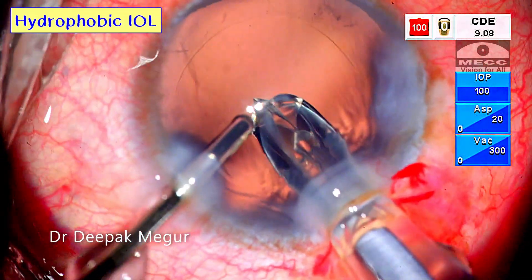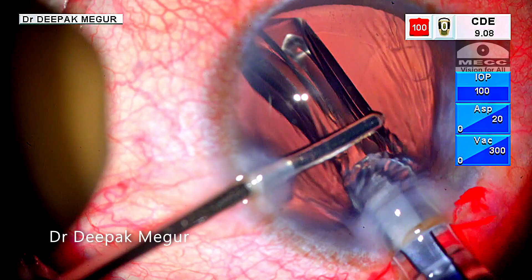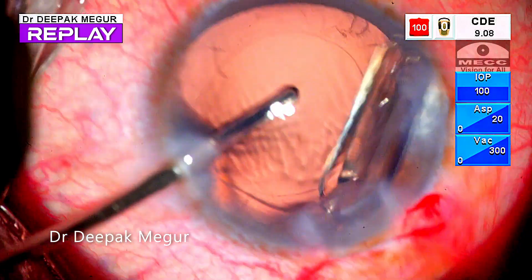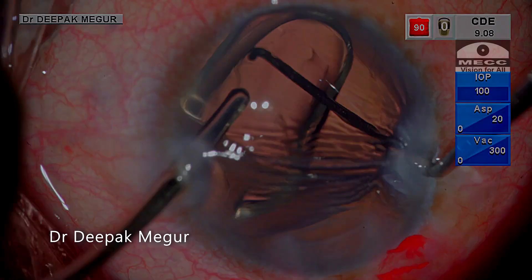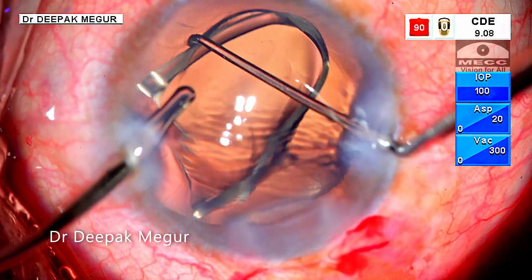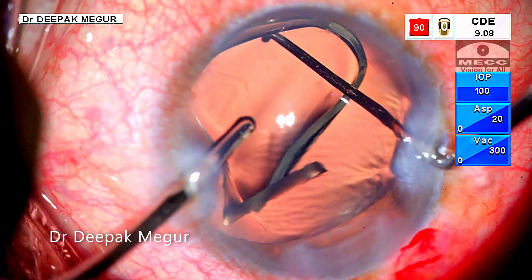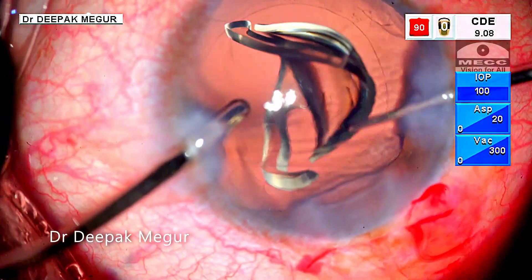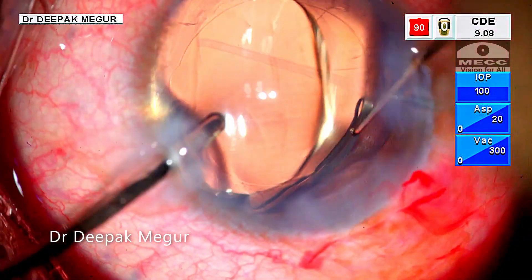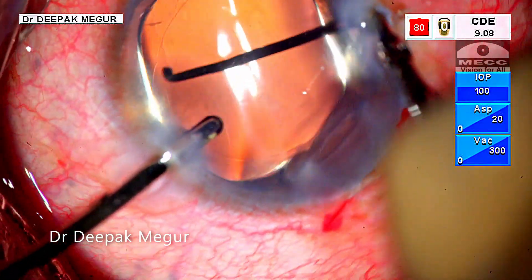Of course, there could be some surprises, as in this case. As I'm trying to implant, the lens does not open up and the folded mass misbehaves like a bullet, jutting around with the current flow of the BSS. There is a chance of the lens hitting the endothelium and also flipping over. In this case, I could control it using the lens dialer and then slowly maneuver it into the bag. In such a situation, one should not remove the irrigation handpiece suddenly, even if you want to replace it with OVD. One should start injecting OVD through the other side port and then remove the irrigation gradually.